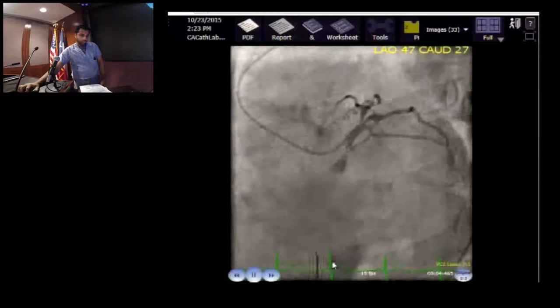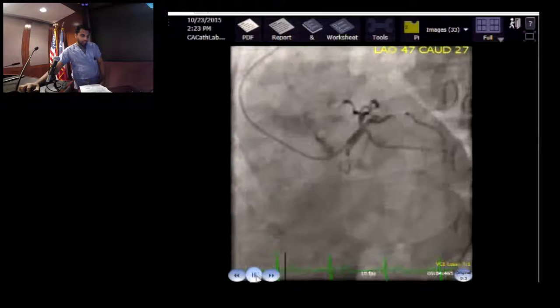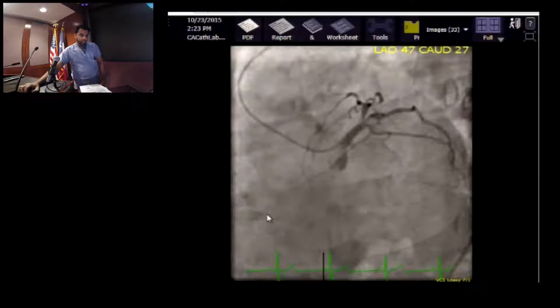So instead of jumping on an angiogram and trying to guess, this is very simple, very intuitive. You see five branches. The smallest one to the extreme left, sometimes you see it, sometimes you don't, is the septal. Then the LAD, diagonal. And then after that is the ramus or a high OM, depending on whether it comes from the left main or the circ, and then finally the circ. So you know which branches you need to trace. Okay? All right. Please carry on.